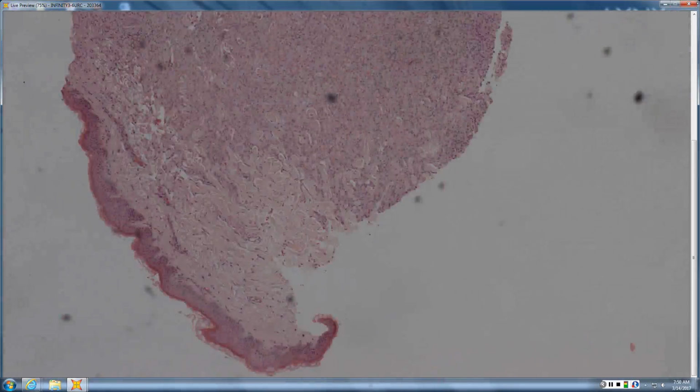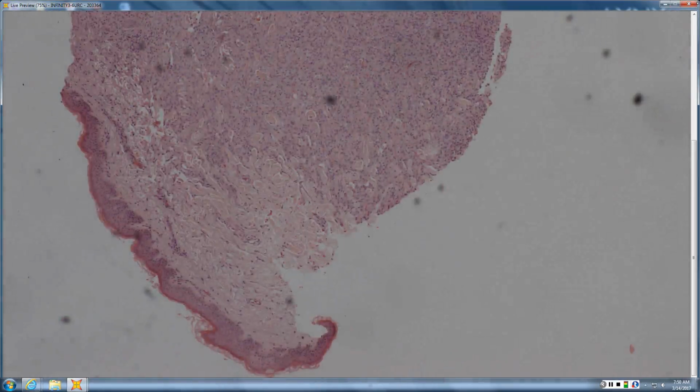You can look at it immunohistochemically, but the easier thing to do is usually look at the patient's lipids. Do they have a reason to have a xanthoma, or is this one solitary lesion that's more likely just a dermatofibroma?